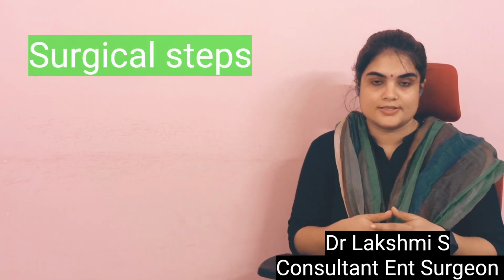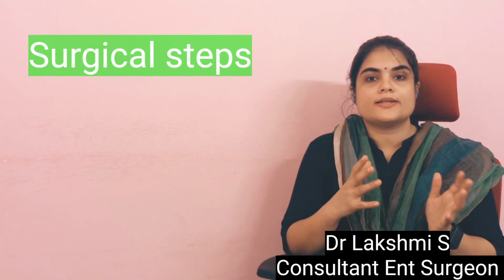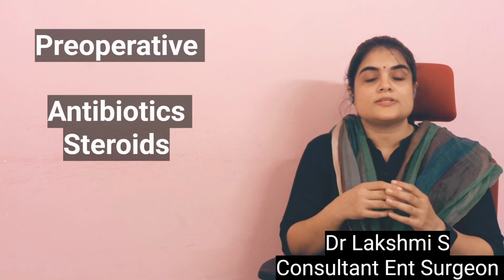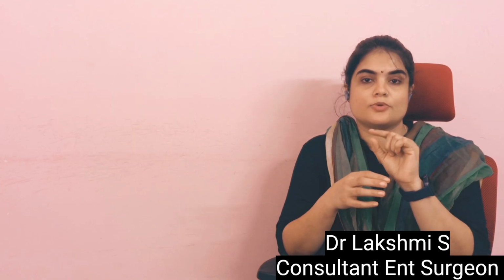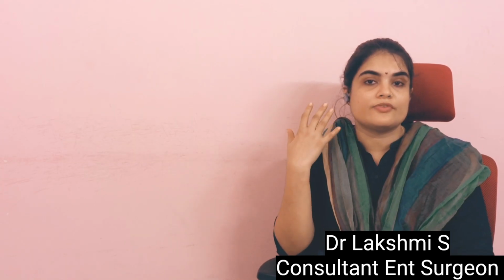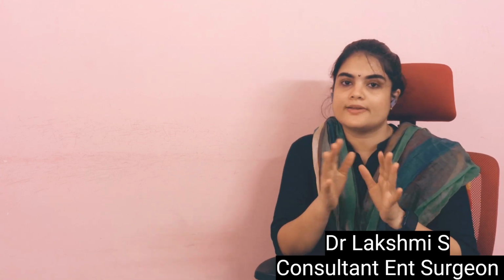So how do we do the surgery? Pre-operatively, you can give the patient antibiotics. For surgical prophylaxis, first generation cephalosporins can be given. We can also start the patient on steroids because we are creating a hole in the footplate and entering the vestibule. This can cause some amount of labyrinthitis. So to prevent the complications of labyrinthitis, you can start the patient on a short course of steroids, which can be continued for 1 week post-operatively and then stopped.